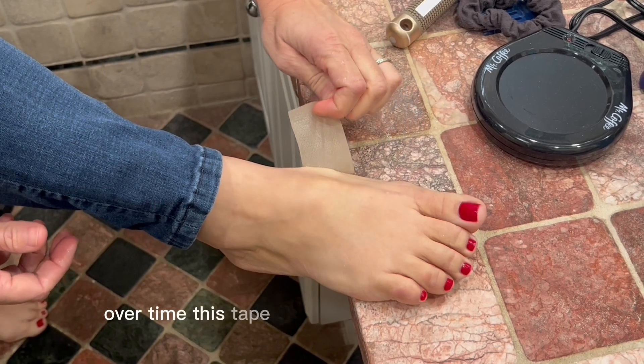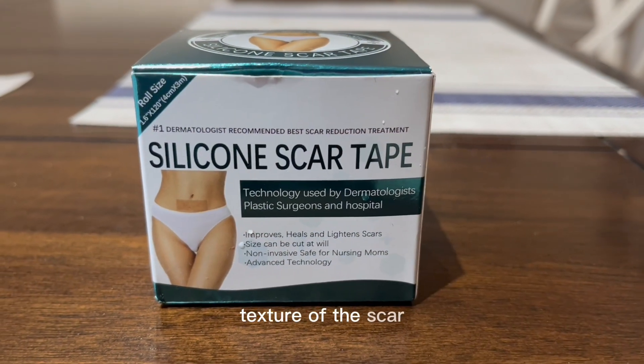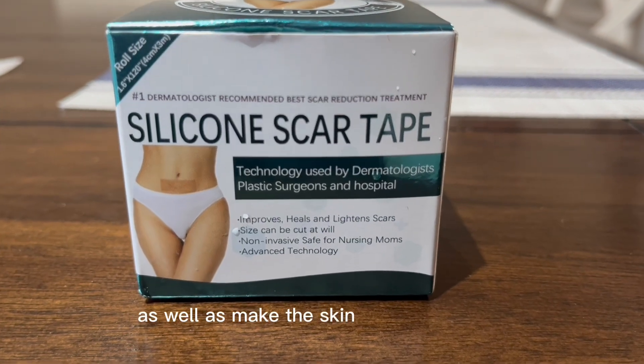Over time, this tape will improve the color and the texture of the scar as well as make the skin smooth and soft.